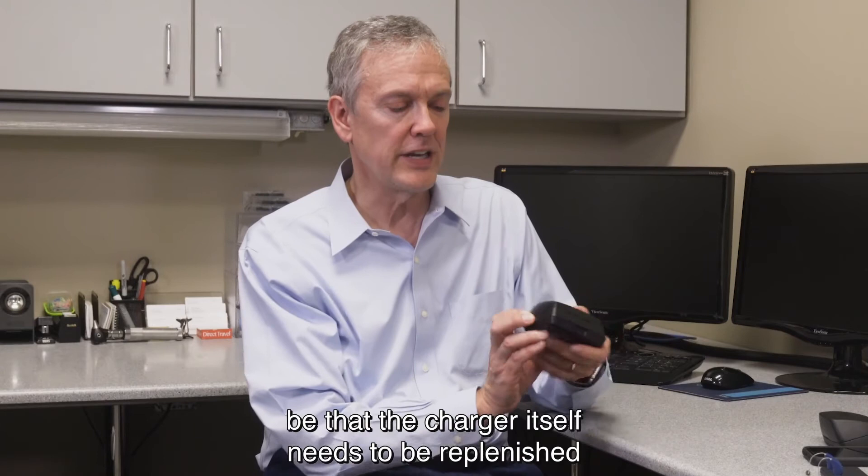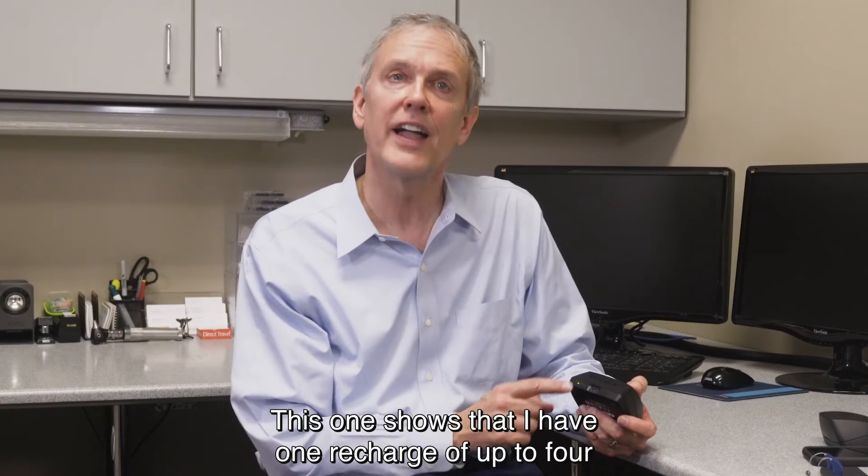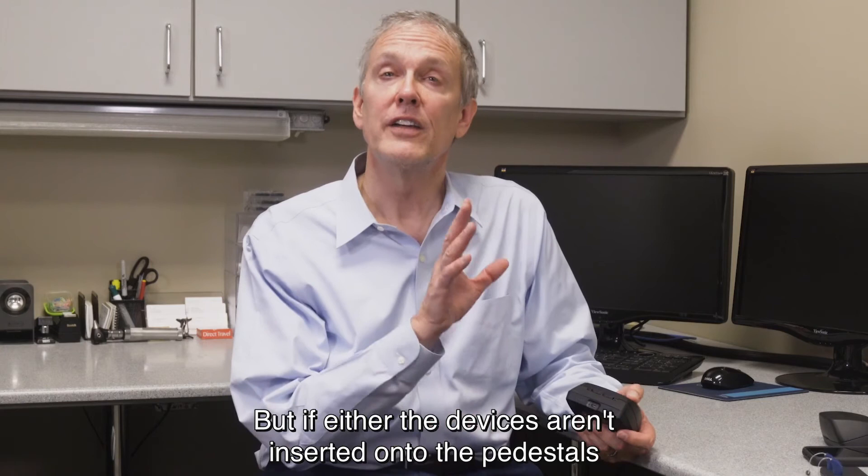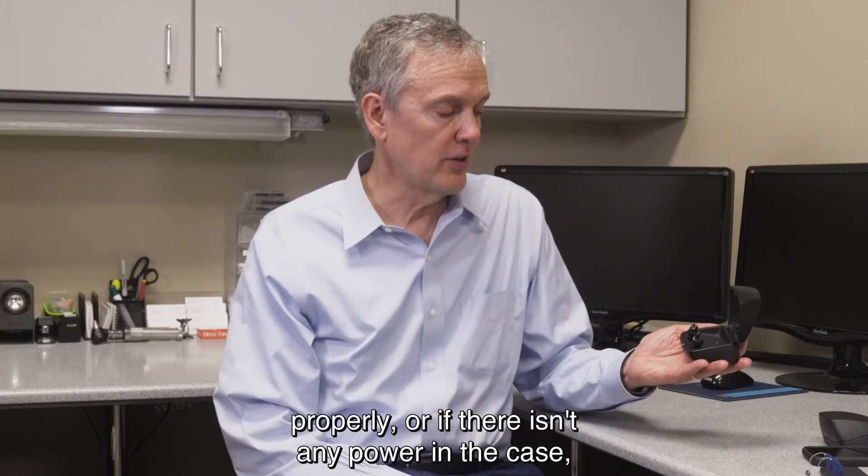If that isn't the case and you're seeing nothing, it could be that the charger itself needs to be replenished by plugging it into the wall. This one shows that I have one recharge of up to four before I need to plug it into the wall again. So if either the devices aren't inserted onto the pedestals properly, or if there isn't any power in the case, those could both be the culprit as to why your hearing aids aren't recharging.